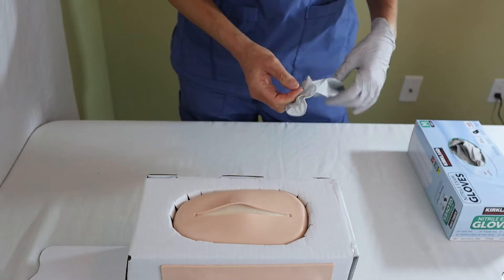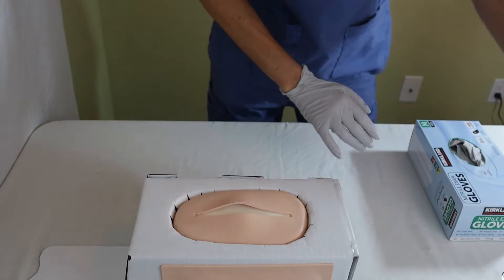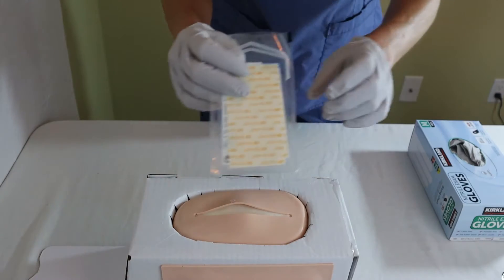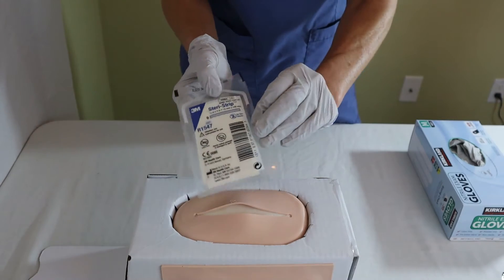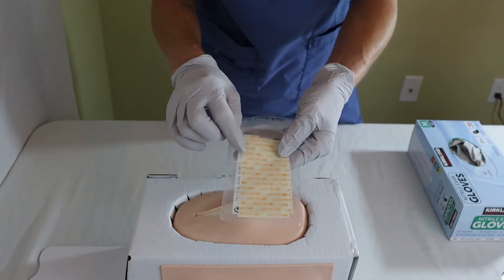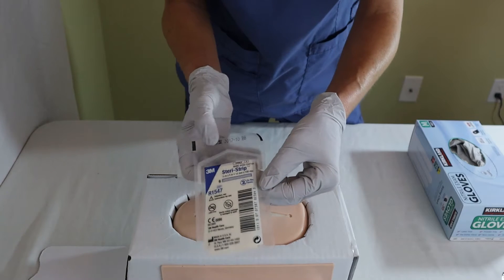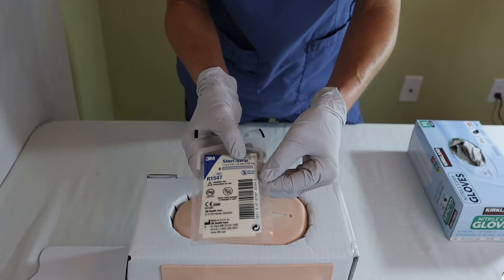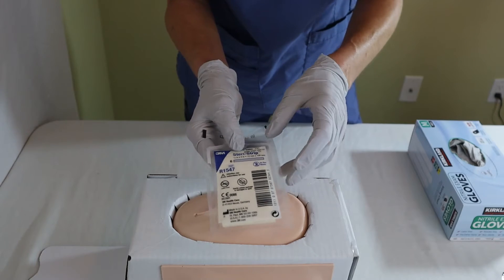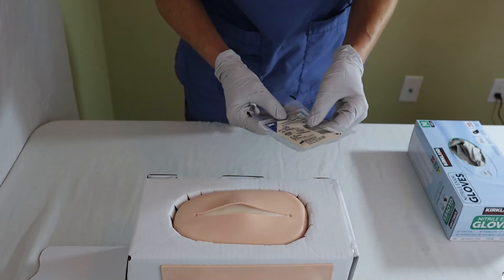You need to select the correct size of SteriStrips. They typically come in one length and different widths. In this case, these are a half an inch by four inches long, or 12 millimeters by 100 millimeters long. The length is typically the same, although they do come in bigger strips.